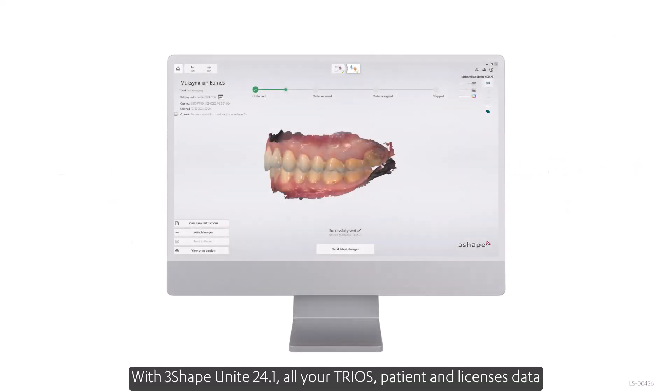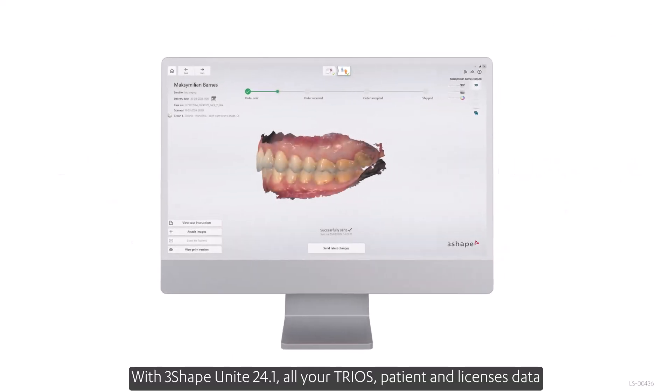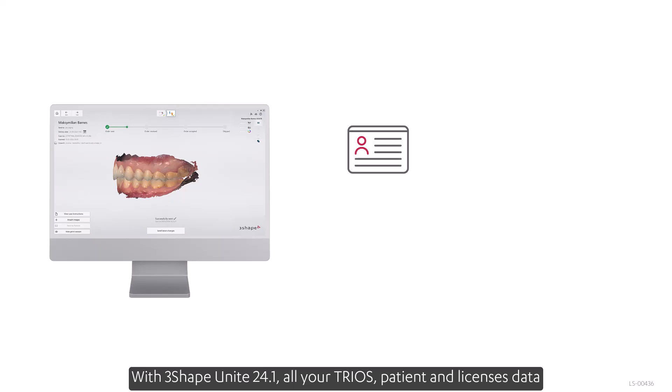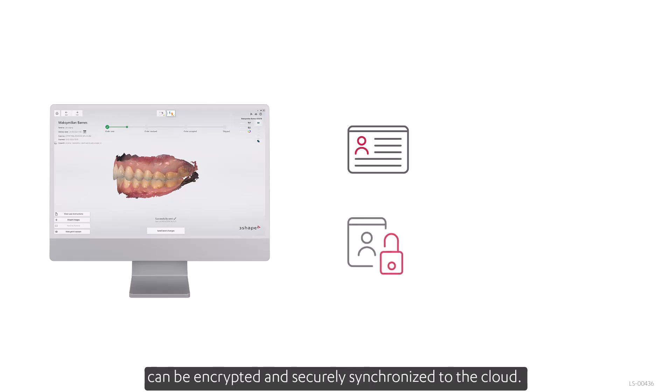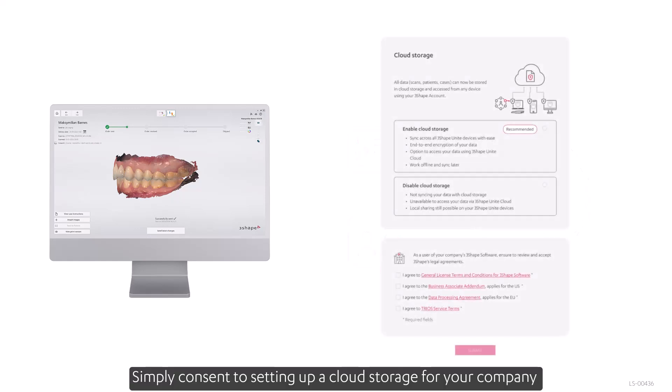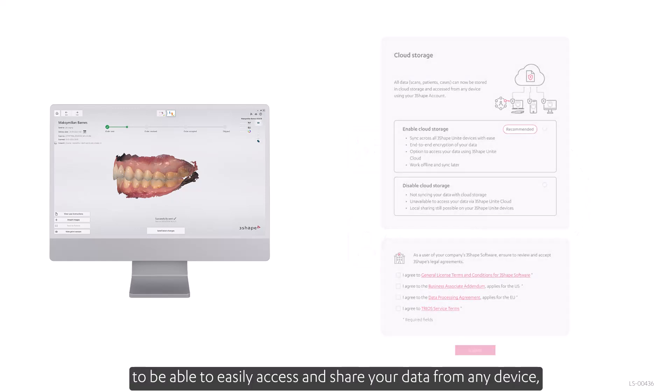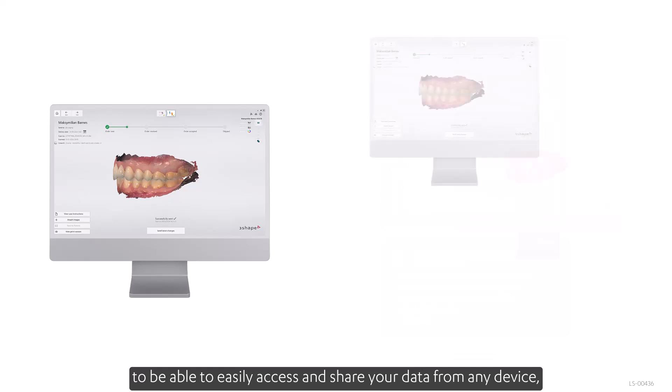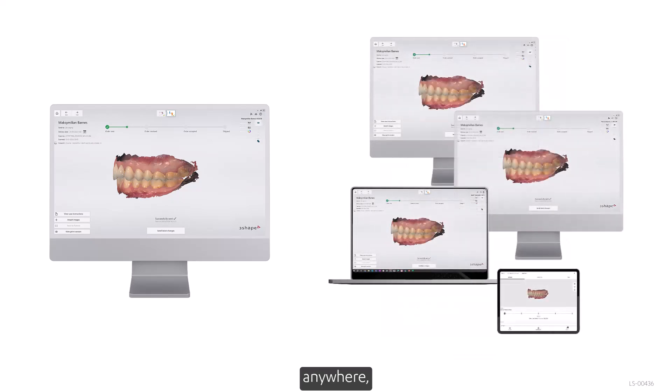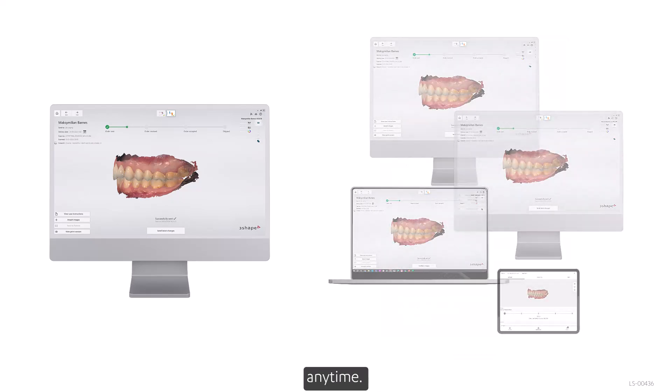With 3Shape Unite 24.1, all your trios, patient and licensed data can be encrypted and securely synchronized to the cloud. Simply consent to setting up cloud storage for your company to be able to easily access and share your data from any device, anywhere, anytime.